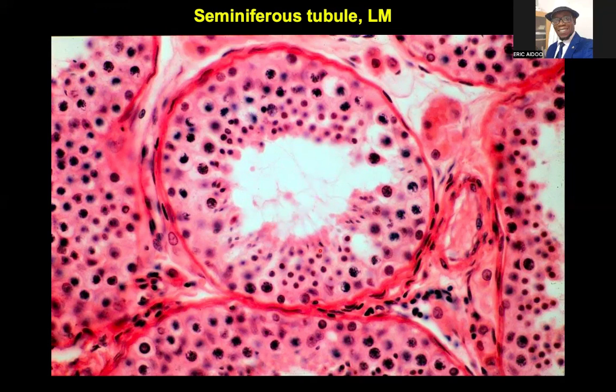That's a spermatid with an oval-shaped head. There's another one. All these regions will contain spermatids. Then you have secondary spermatocytes, then primary spermatocytes, and then spermatogonia, dark and pale type. Then obviously the Sertoli cells will also be there. Then you expect to find Leydig cells in the interstitium.